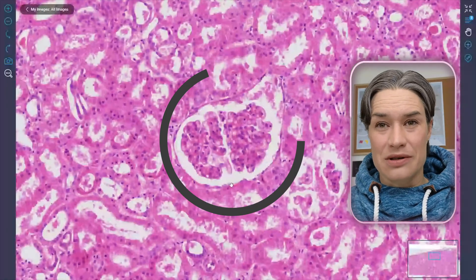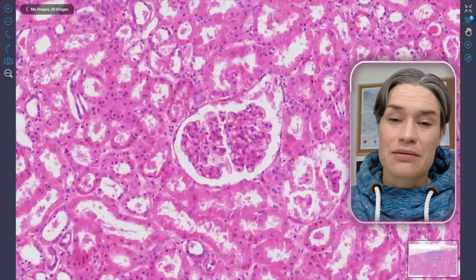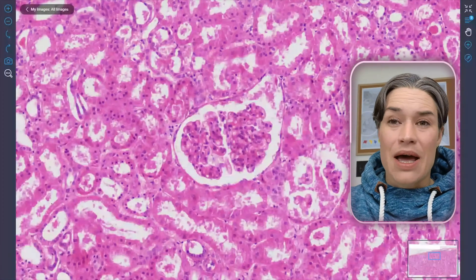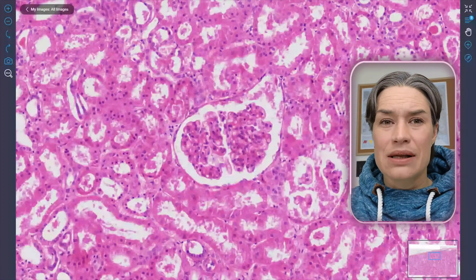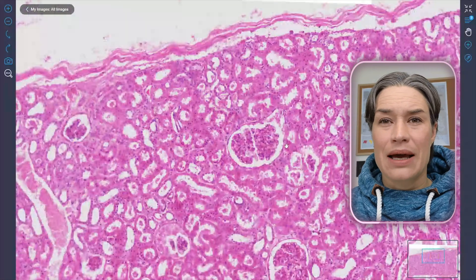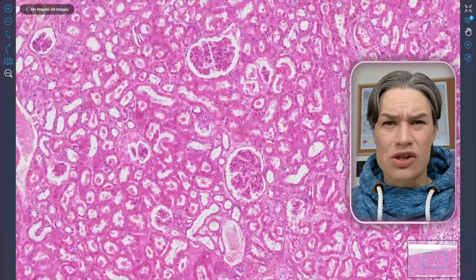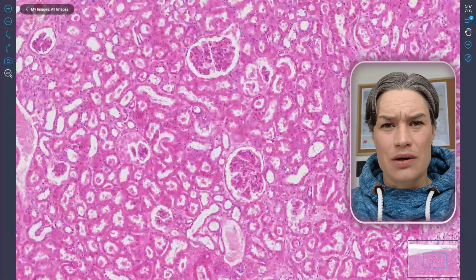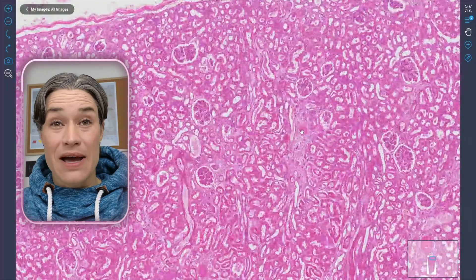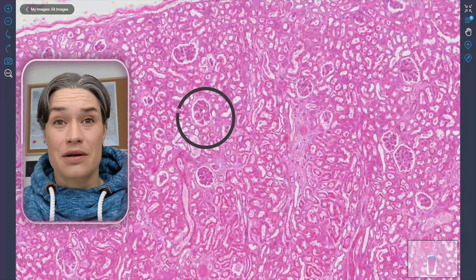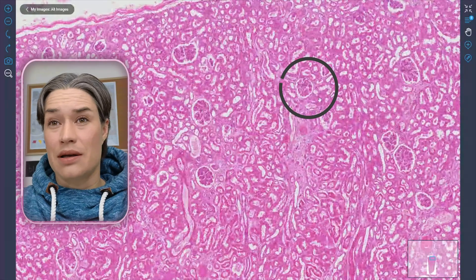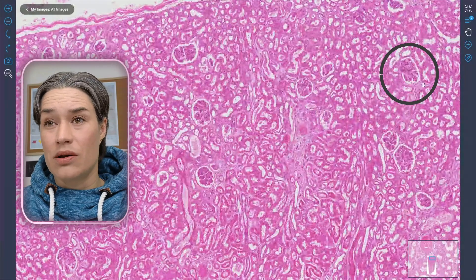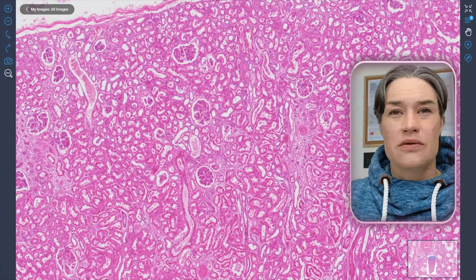This is the glomerulus. It's more or less round in shape and looks a little bit like a clover flower. So if you find them here, here, here and here, and all over the place, you know you're in kidney. But there's a lot more to kidney, so let's dive into it.